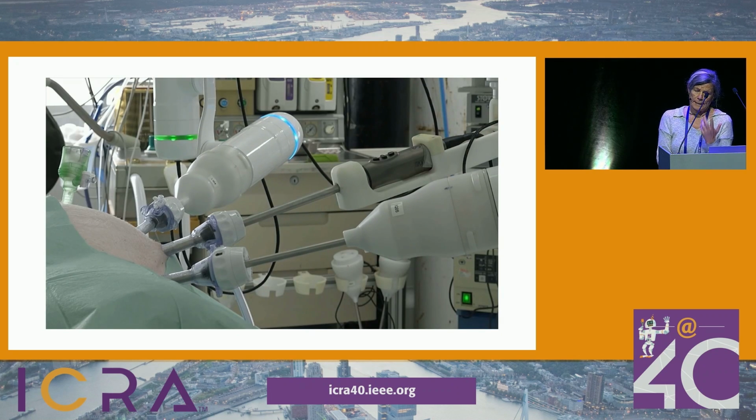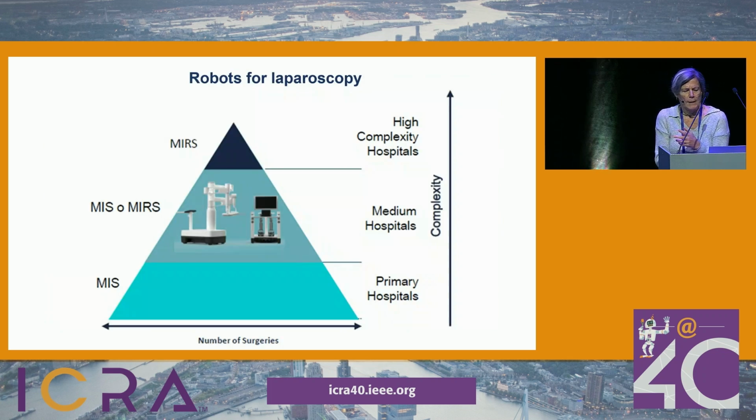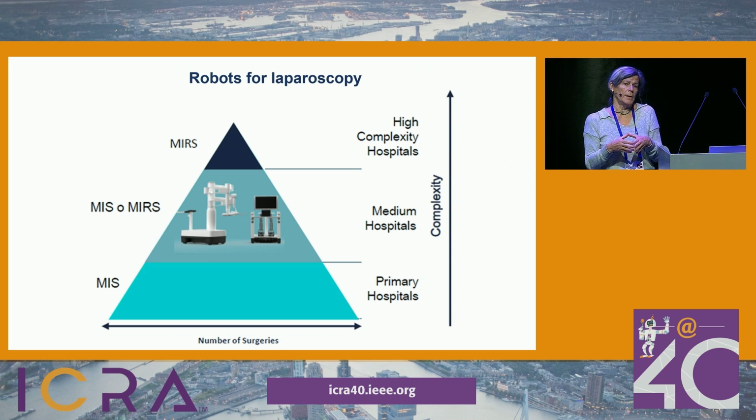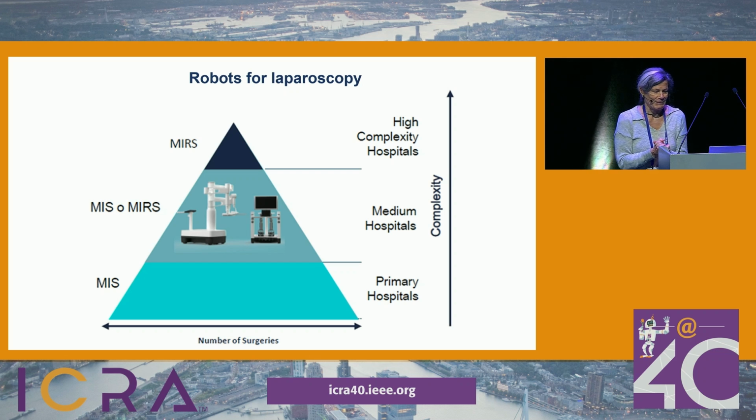And with this goal, thinking about usability and simpler equipment, the challenge is to move from robots that are useful and very appreciated by surgeons and patients in the operating room, but can only be afforded by big and complex hospitals, while we pretend to reach medium hospitals in which the number of surgeries per year does not justify having one such system. And these are the considerations I wanted to put on the table.